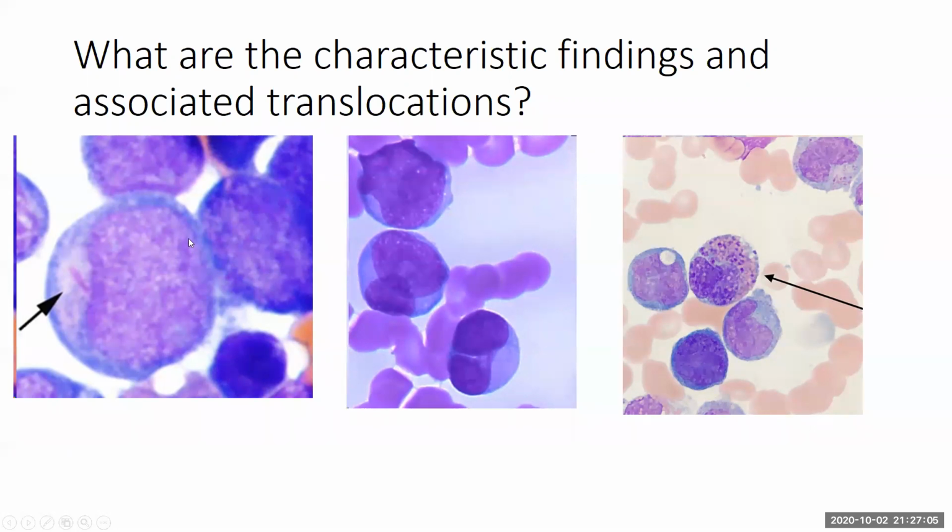being on heme, it's very important to have morphology in mind, because karyotypes take a long time to turn around, probably over a week. However, if you are looking at the aspirate smear and you see this morphology and think this is 8;21, you can let the cytogenetics lab know upstairs, like Rachel Sears and Angela Lager, that we think this morphology is fitting for this certain translocation.